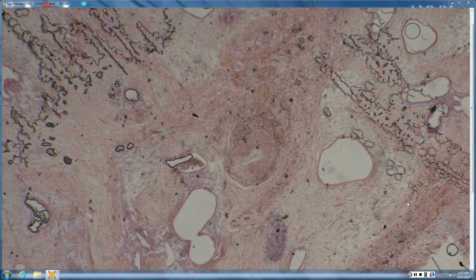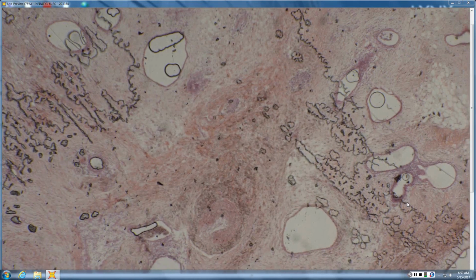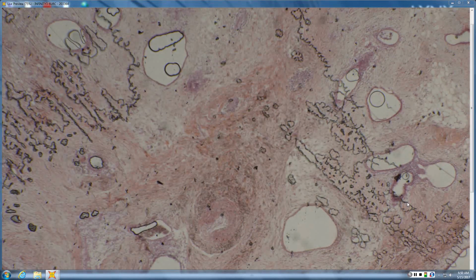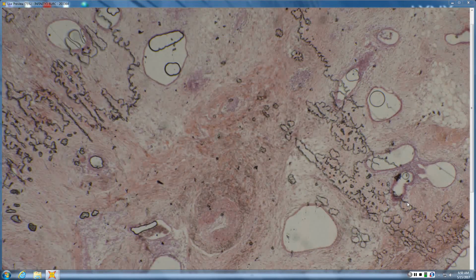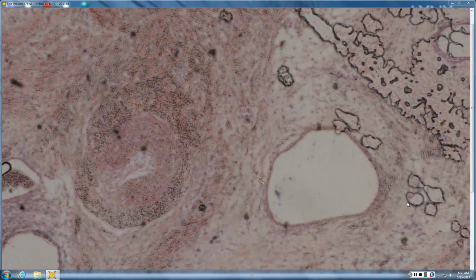This is endometriosis. And this one, you certainly can see it in the skin, and I don't know if it would actually be on the boards, but it certainly could be, and it's very much testable, particularly because it looks like it's some sort of tumor or something. So it's more this pattern that you have to be able to recognize. And the pattern is that it's fibromyxoid stroma. It's just not very dense or cellular. There are these large, ectatic, what appear to be glands. And then there's usually lots of blood and erythrocytes throughout the background stroma, and otherwise it looks very bland. And when you put all that together, that speaks to endometriosis.